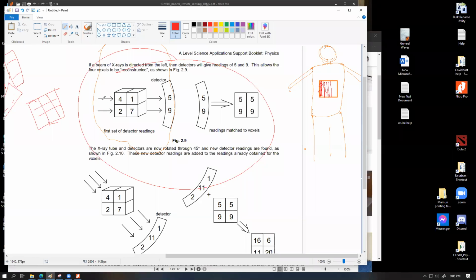If you stack another set of slices over here, so in this case we're going to have 2 by 2 by 2, that will be a 3-dimensional block. This is still considered to be a piece of paper, or a 2-dimensional image where you have the thickness of one slice. Then if you stack up multiple of these in front of it, for example, if I just take this image, and I would like to show you what I mean by stacking it up. Let's say I do transfer selection and then copy it, and let's say this is stacking up. This would be the next slice, which wouldn't have the same values, but we have to scan that as well, and then this will be the next slice, and there will be slices behind that as well. So multiple individual slices stacking up together gives you the whole 3-dimensional data.